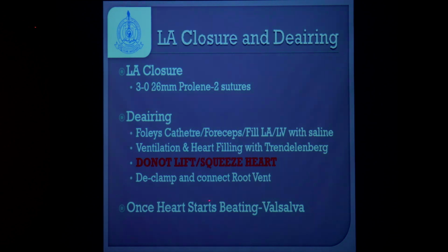At no point after a mitral valve replacement do I squeeze the heart. I do not touch the LV or the RA whenever I have put in a mitral valve. Declamp the root and then do a root vent. Once the heart starts beating, that is when I finally close the LA and close the second suture.